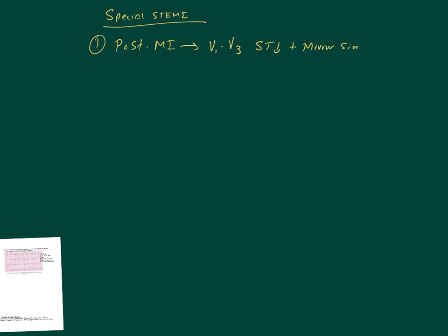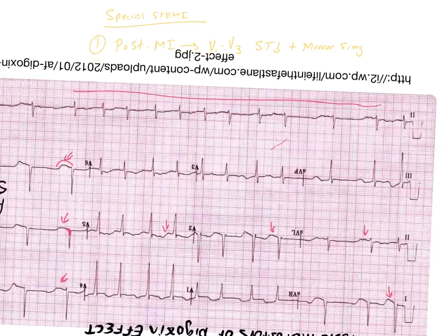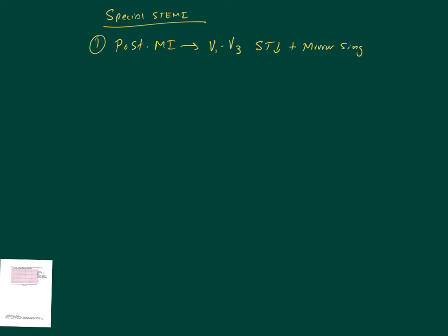Because if you took that dig effect or that pericarditis ECG that we just looked at, would that pass the mirror test? I don't know, can we look at, I mean, I'm assuming no. Can you flip that upside down? I can try. Does it really look like it? No. Not really, does it? It doesn't really look like it. Yeah, so you see that it is very characteristic, that mirror sign.